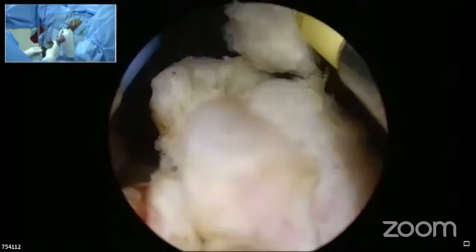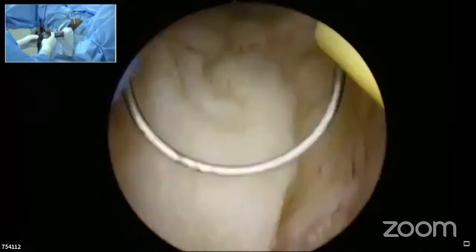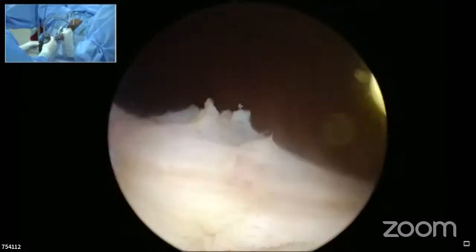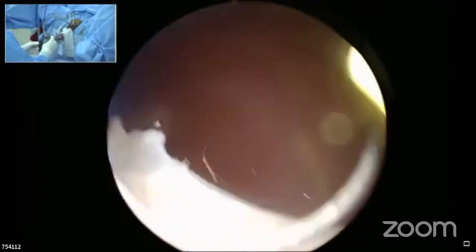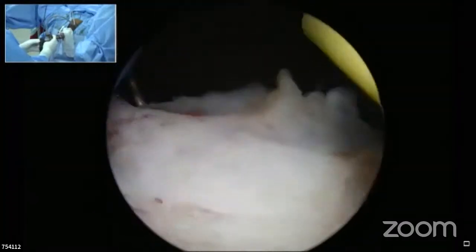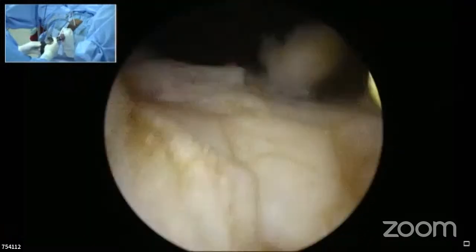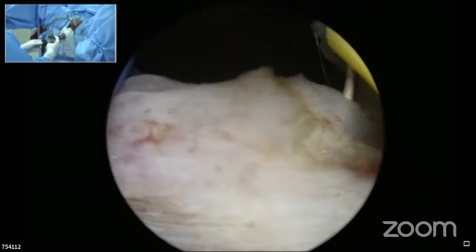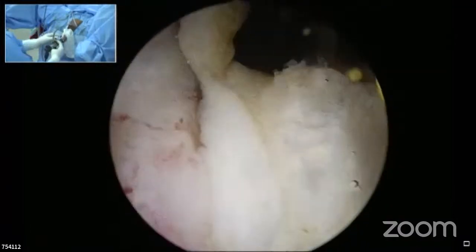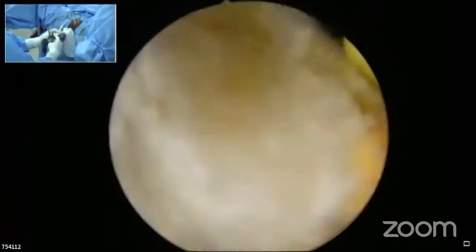What is your tip to resect the median lobe? Suppose you find a large intravesical lobe which is projecting into the bladder. Once we try and debulk, if it is very large, we will find a flap forming here. If this is slightly more overhanging, I hook the flap inside and then take a shortcut rather than a very long cut. Go close, hook the tissue, take it closer to the sheath and just give a small cut. That way you would be fairly confident that you have not taken any trigonal tissue inside your loop cut.